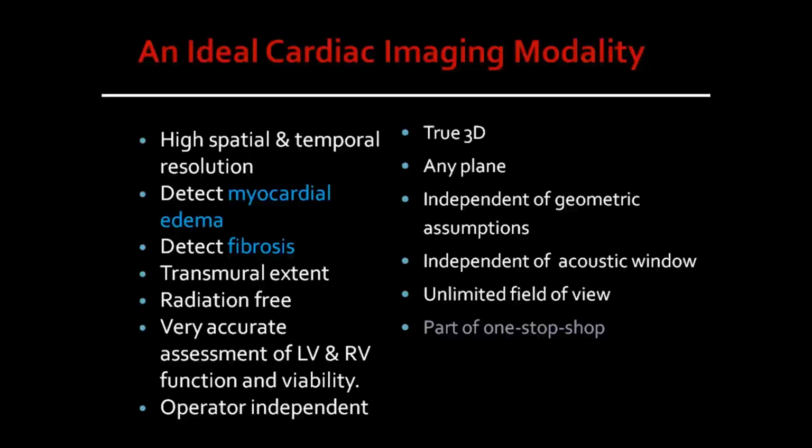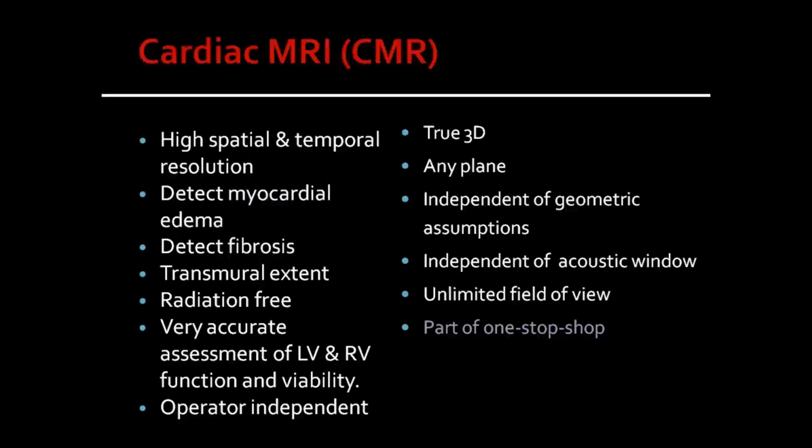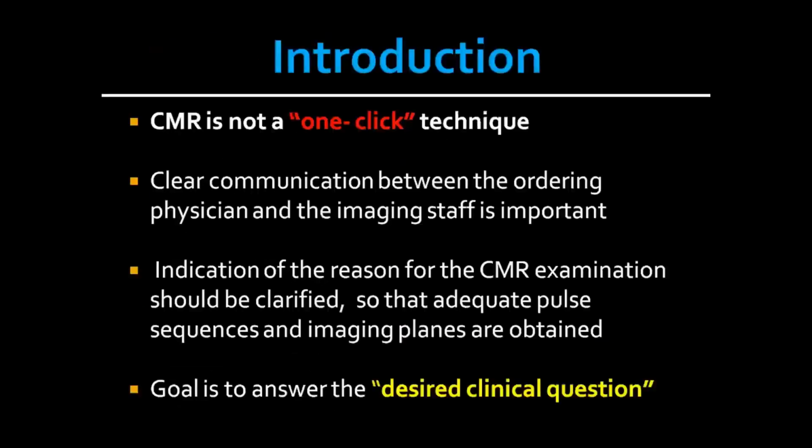An imaging modality with unlimited field of view, and finally, part of a one-stop shop. What I mean by part of a one-stop shop is you can do function, viability, perfusion, and look at the anatomy. So if we just change the title of this slide to cardiac MRI, these are actually the advantages of CMR.